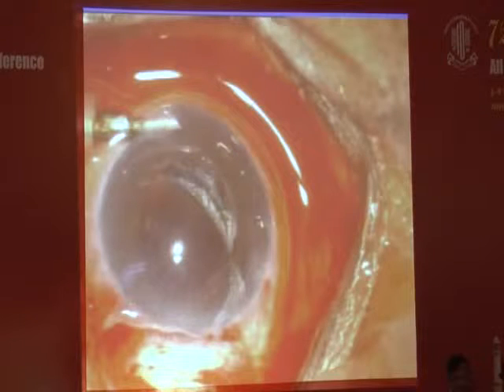So here, once the nucleus has gone behind, always remember, which is not possible, so keep your cool. Forget that the nucleus has gone behind, because there are so many retina surgeons in India, they will require some of the things. If you eat everything, what will he eat? And another thing is, whenever a retina surgeon operates, there is no cold case. I will tell you why. Because he operates for 3 hours. He takes too much time.